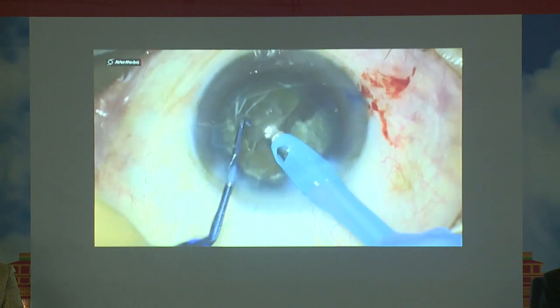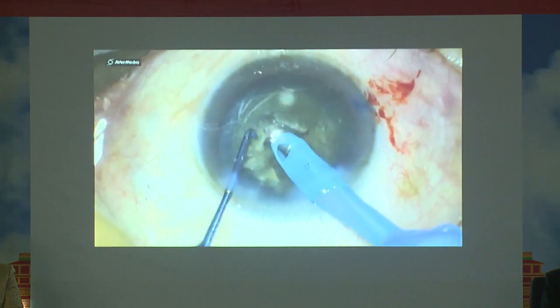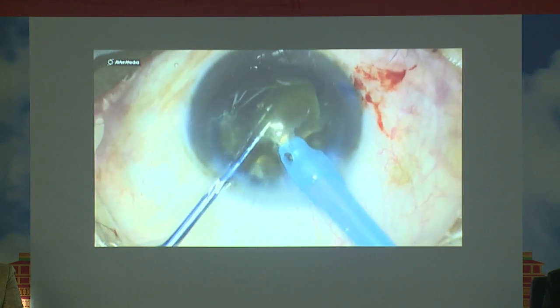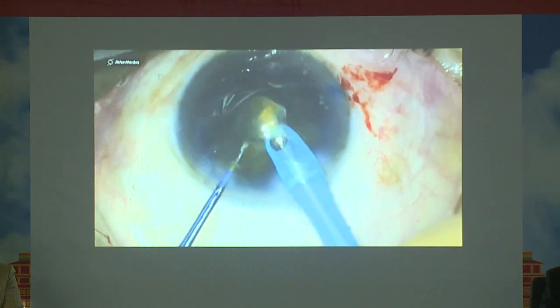And multiple sub-chops are being done. And this is the small central endonucleus which is first emulsified. And we can make further sub-chops whenever it is necessary. And we change from the sharp chopper to the blunt chopper when we try to eat each piece.